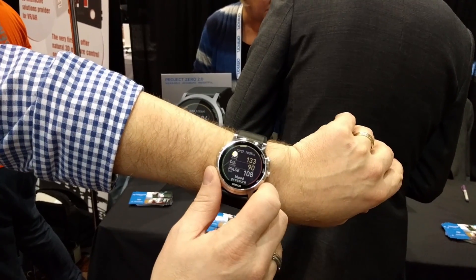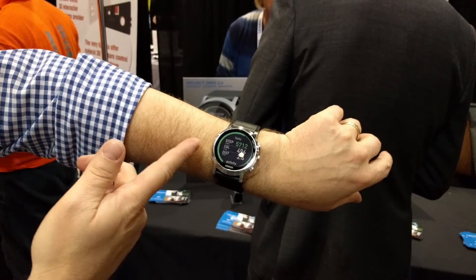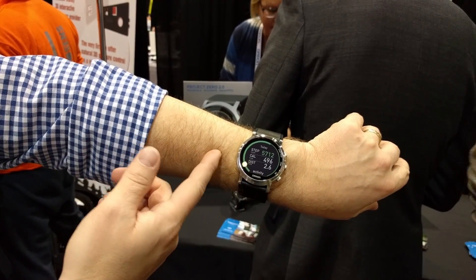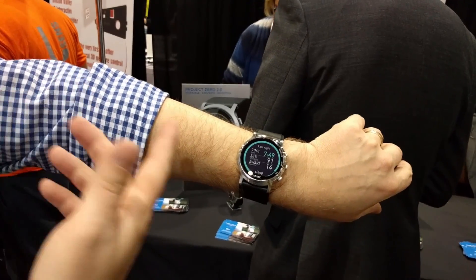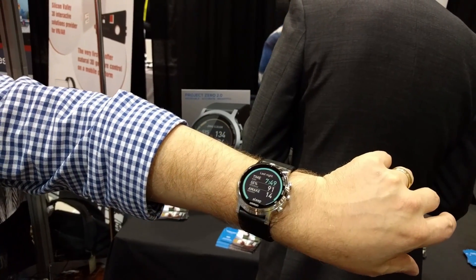Not only blood pressure — if I continue to scroll through, it's also an activity tracker. It tracks my steps, my calories, my distance, as well as my sleep. If I were to wear this at night, it tracks when I went to bed, when I woke up, how many times I woke up, and whether I was restless. Because all that plays into the conversation you have with your physician about managing your heart health.